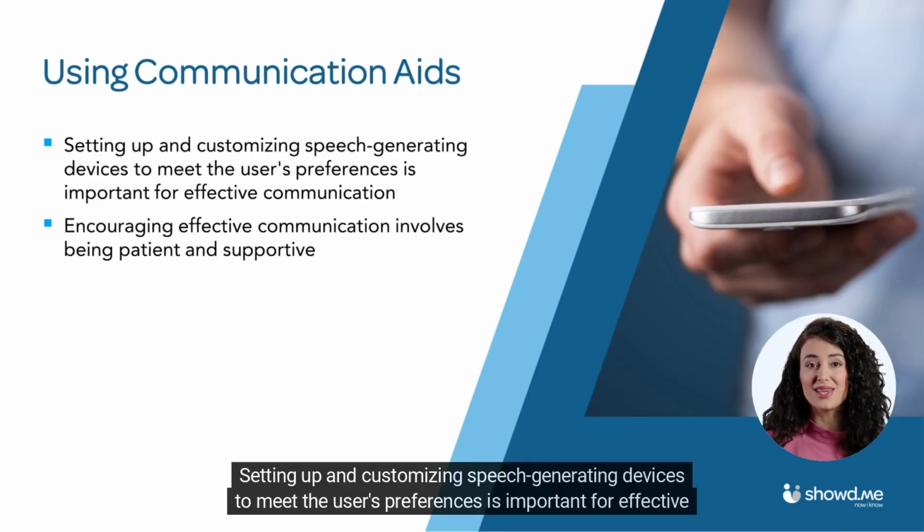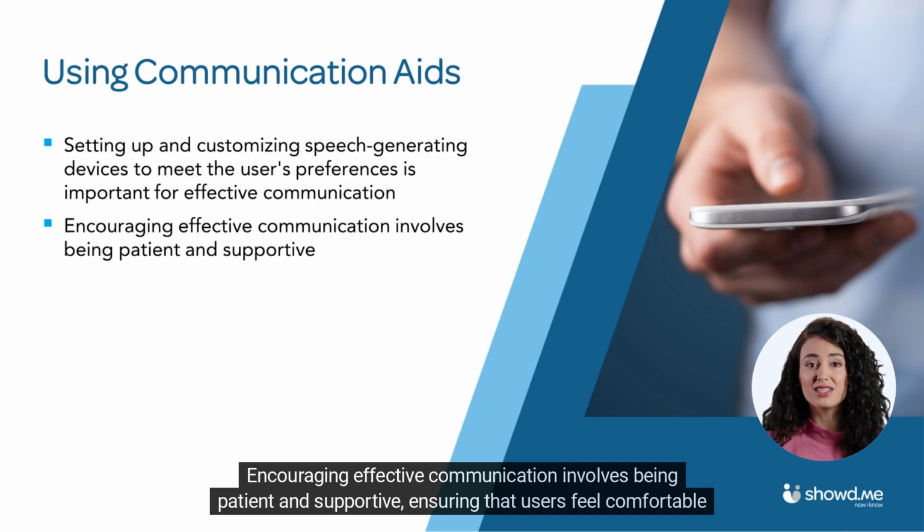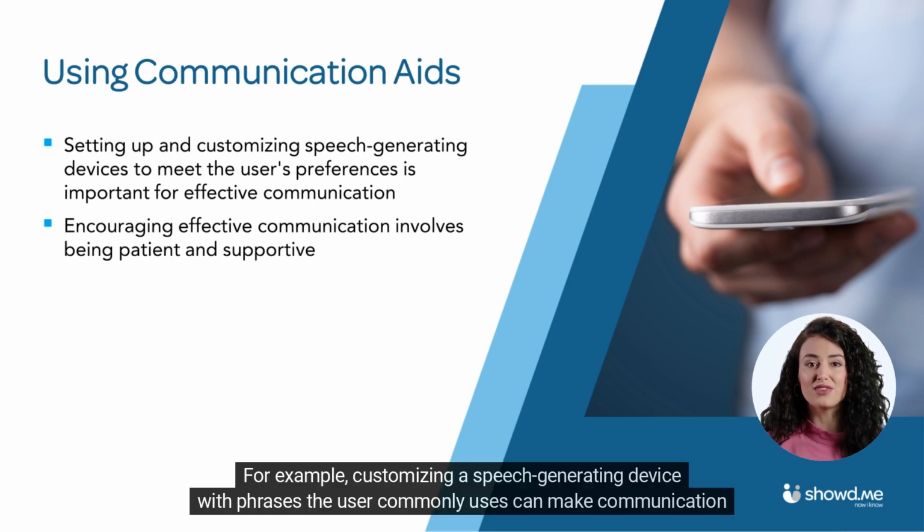Setting up and customizing speech-generating devices to meet the user's preferences is important for effective communication. Encouraging effective communication involves being patient and supportive, ensuring that users feel comfortable using their devices. For example, customizing a speech-generating device with phrases the user commonly uses can make communication smoother.